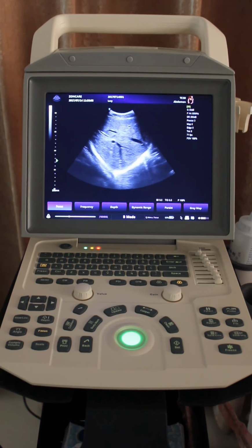For example, the right hand is the image that the doctor has already checked with the patient. We want to move the image to the right hand. We should press set and the trackball at the same time to move to the right hand to fill the blank.